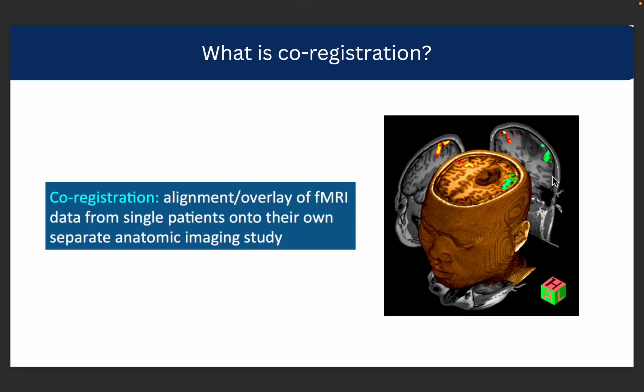So what is co-registration? Co-registration basically allows us to align two or more MRIs of the same patient. It is different from normalization because in normalization we align all the MRIs in the dataset to a standard format. But in co-registration we focus on one patient only and make sure that all the different modalities of that patient are properly aligned.